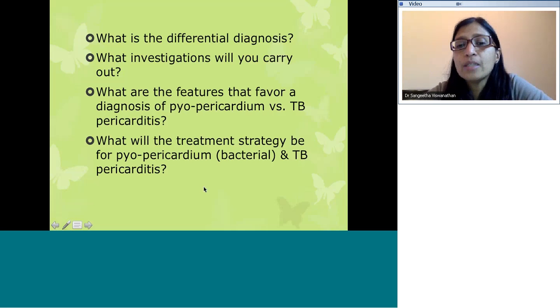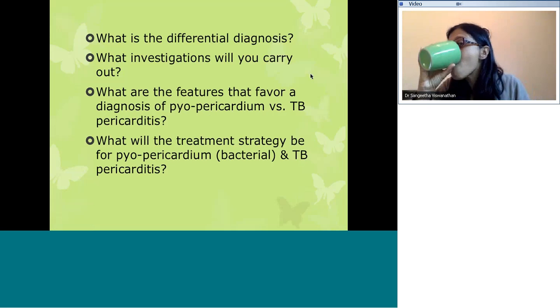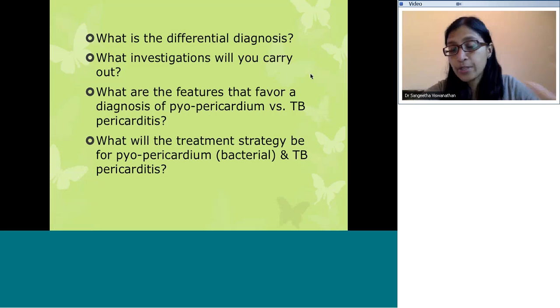So what will the treatment strategy be? If it is a pyopericardium, what should you do? How would you treat it? Quick, it's very simple. Collection of pus, correct. But only IV antibiotics is unlikely to do the trick. You saw the collection, right?